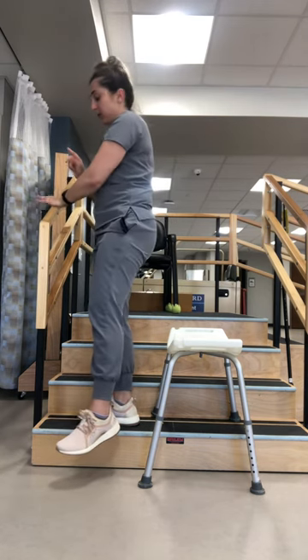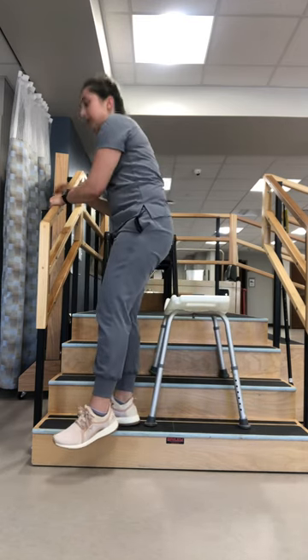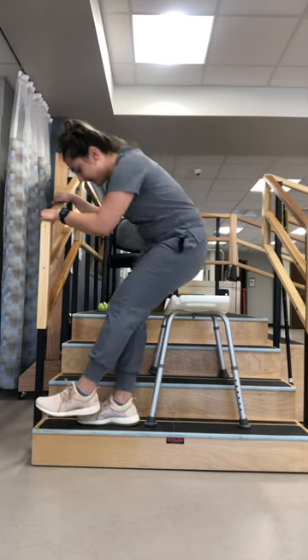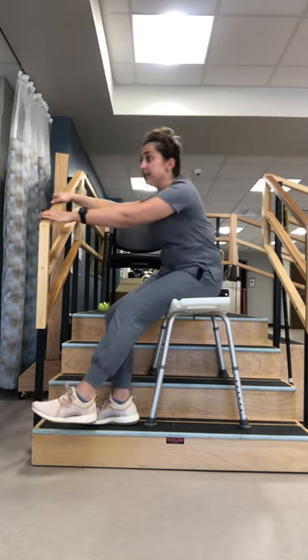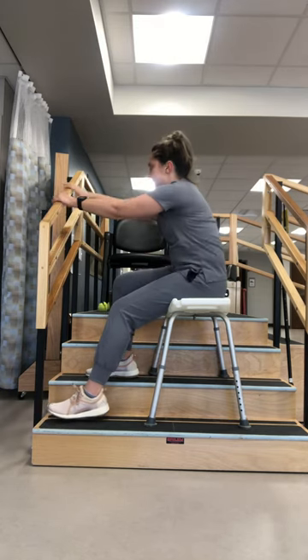I'm going to pull myself up with the rail, use one hand on the rail, lean back, and advance my shower chair one step. Now with both hands on the rail, I can lean back, sit, advance my good leg one step — and I'm never putting weight through my bad leg.